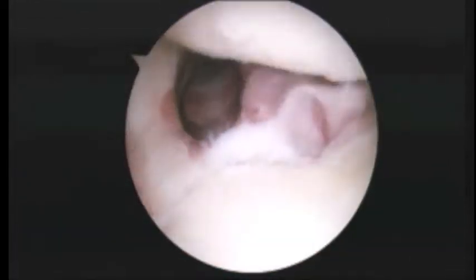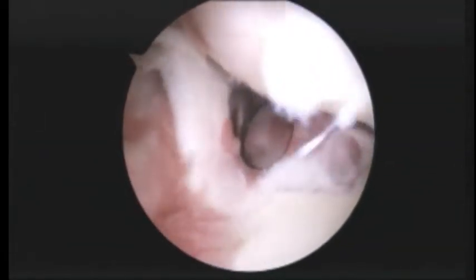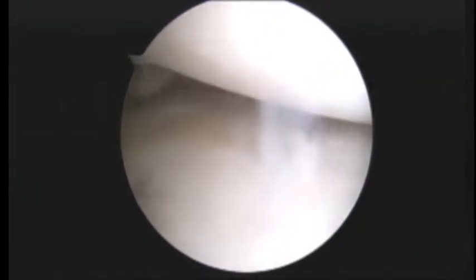We're looking in from the back to the front. Everything that you see is magnified 30 or 40 times on the screen, and you're laying on your side, so the arm is up in the air. The socket part of the shoulder is down at the bottom part of the screen there.